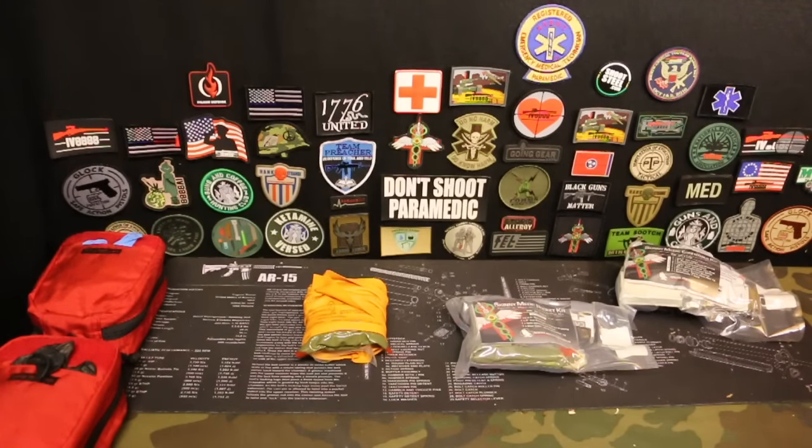So let's start off with the hemorrhage control kits. These kits are just designed to stop major bleeding. They don't take care of any kind of respiratory or breathing problems. It's just to stop major bleeding. So I'm going to show you some components that you need to look at and show you a couple of examples that I have.